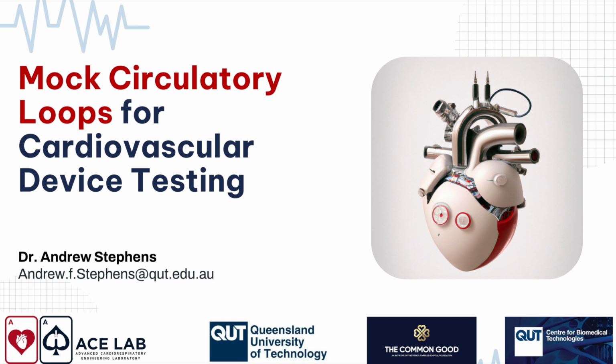So this curve can move up and down based on heart failure, based on emotional state, whether you're in exercise, and so on. So this is a really simple example of how we can measure things and then use the mathematical modeling in the mock loop to replicate certain physiological functions.